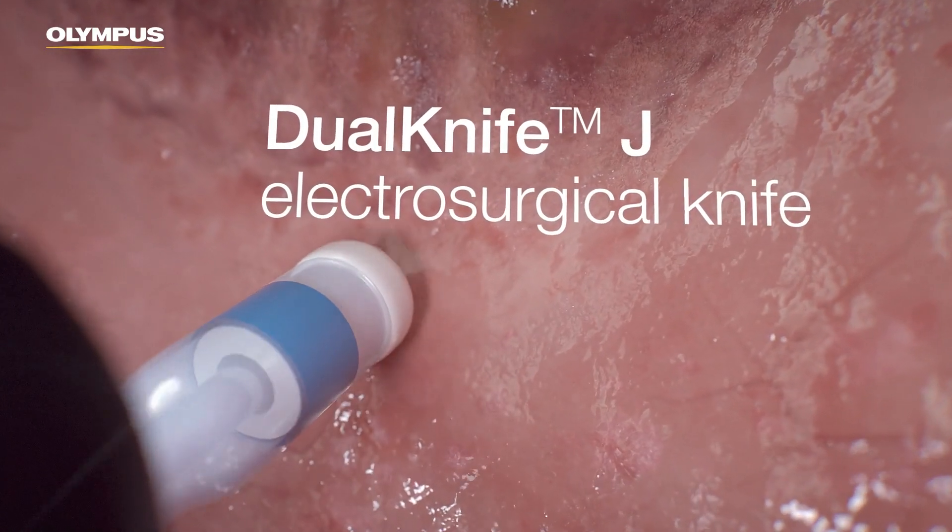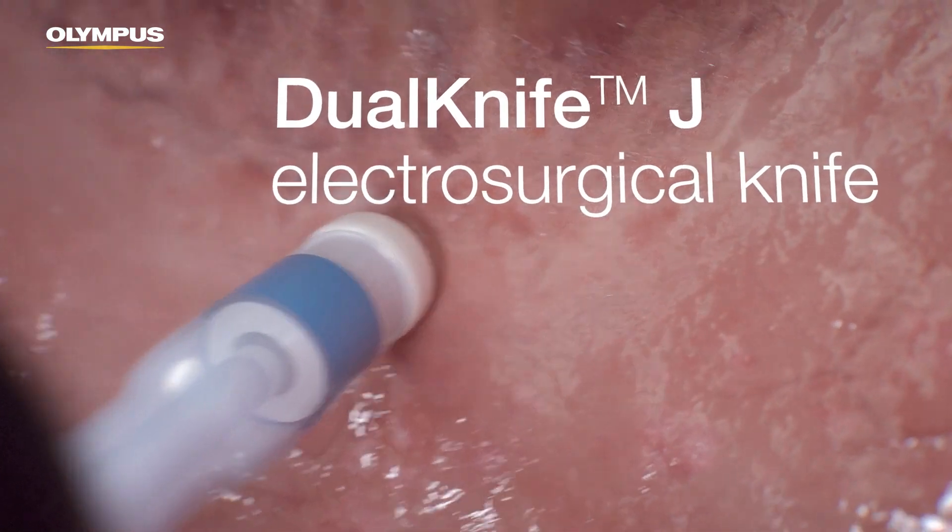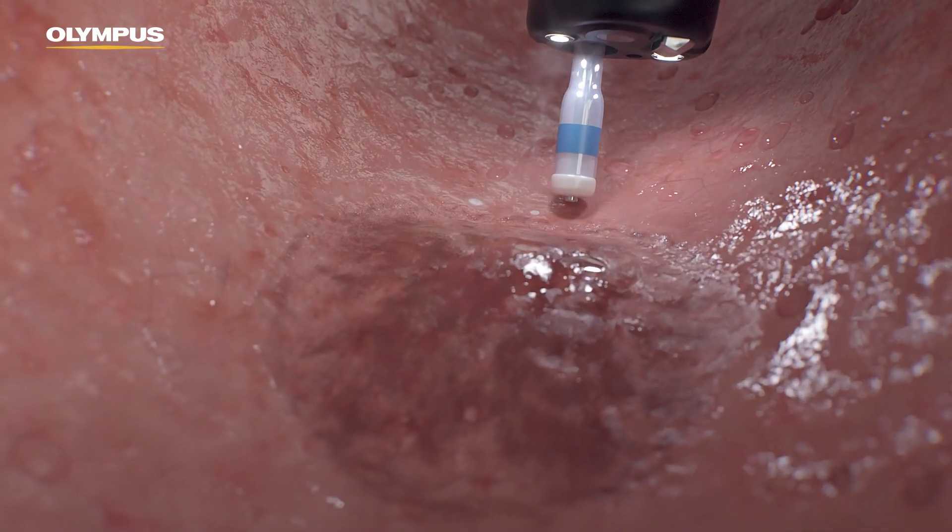The versatile Dual Knife J Electrosurgical Knife can be used to incise, mark, inject, and dissect.